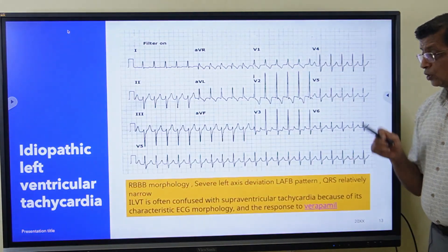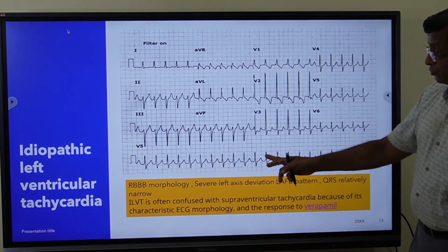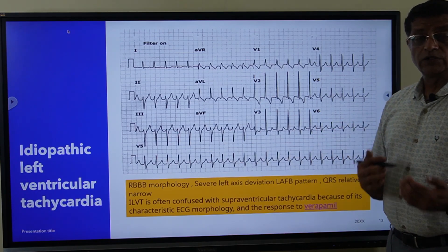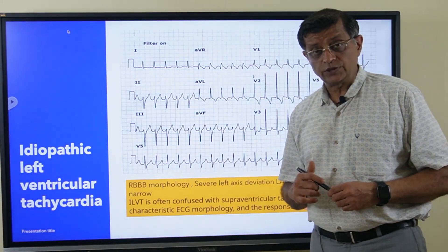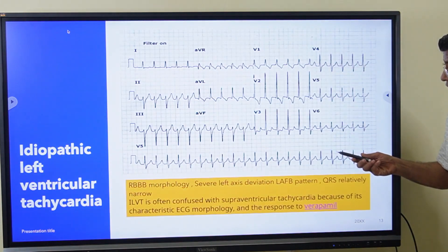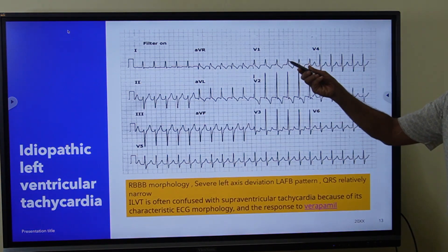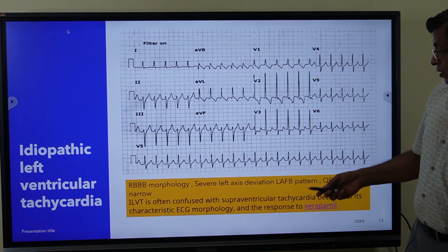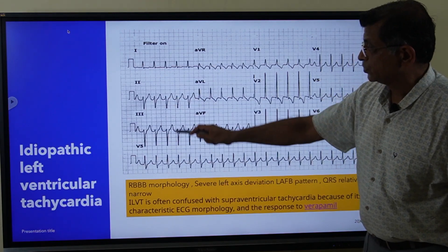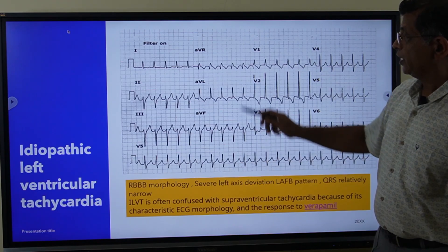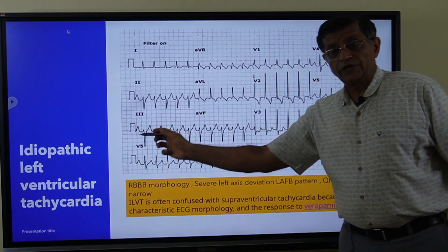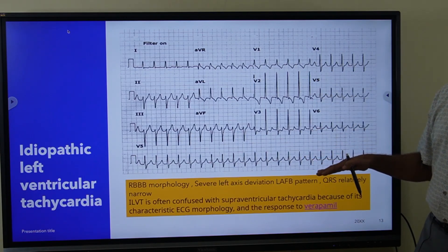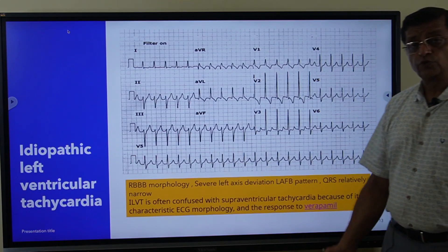Tachycardia-induced cardiomyopathy has been known to occur with this VT. Looking at the ECG, the QRS is not very wide and can be confused with supraventricular tachycardia. Key features to note: P waves are absent, right bundle branch block pattern with tall R waves in V1, significant left axis deviation with all negative complexes in leads 2, 3, and AVF and positive complexes in leads 1 and AVL. The RBBB plus left anterior fascicular block pattern with relatively narrow QRS makes this look like SVT, and it responds to verapamil.